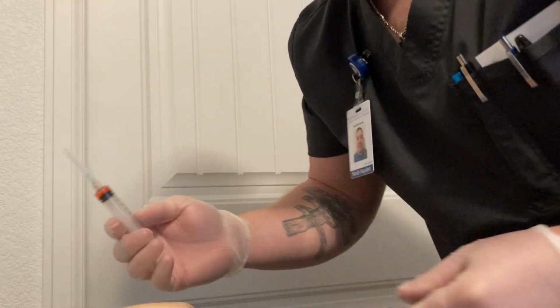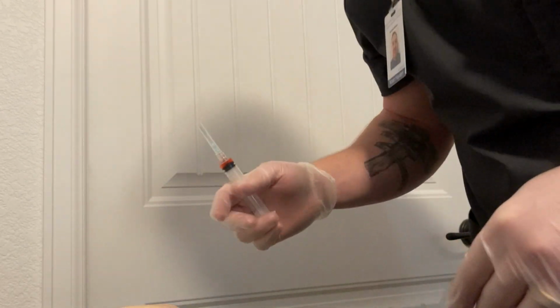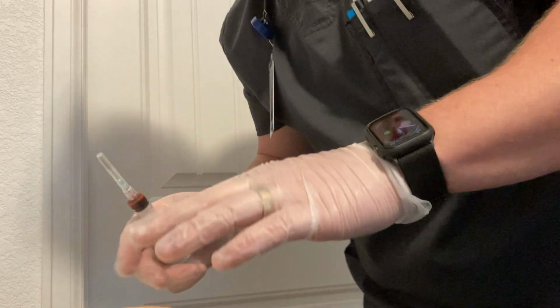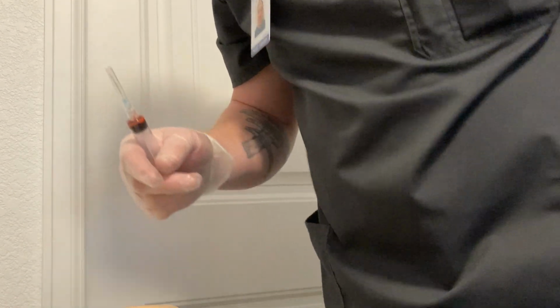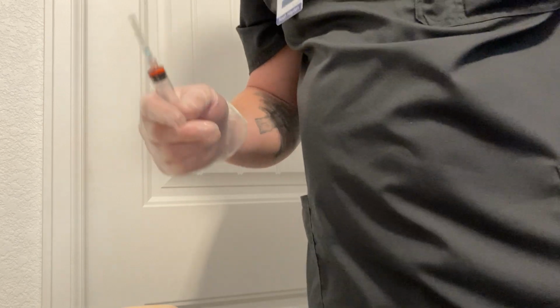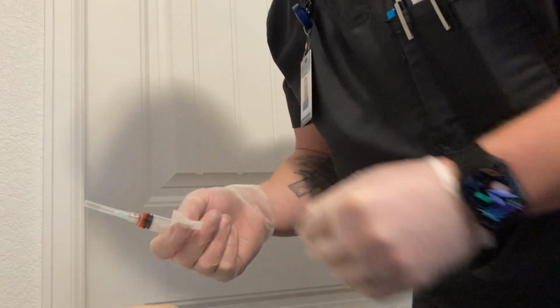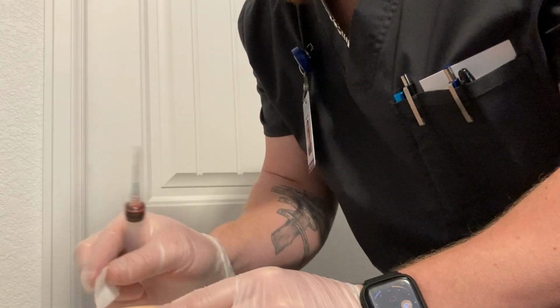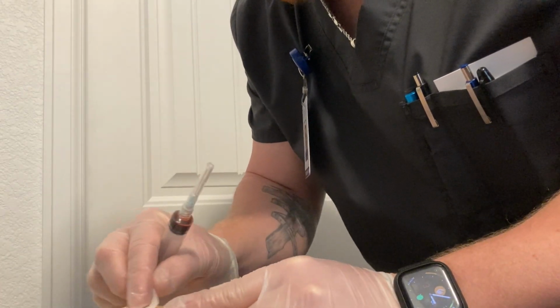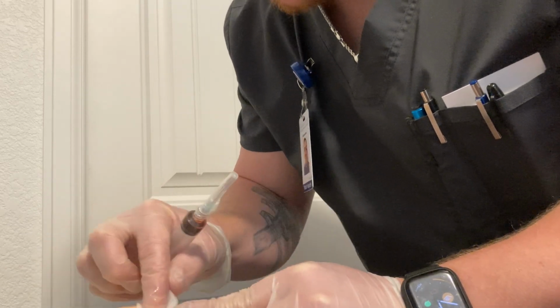I will come into Mr. Smith's room. I will again examine his abdomen. I'll make sure that everything looks still appropriate. I will approach the site selected, which is the abdomen away from the umbilicus. I will clean the abdomen and the site, starting at the center, moving out 2 inches on either side.